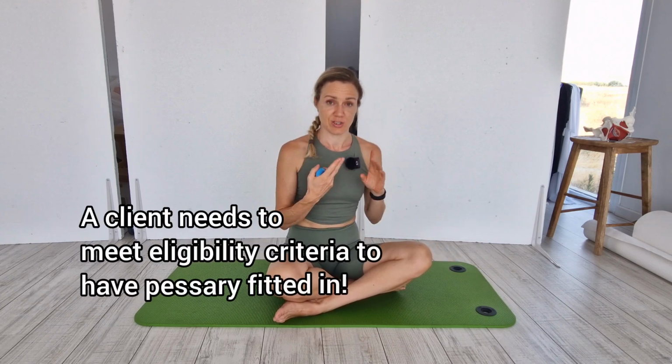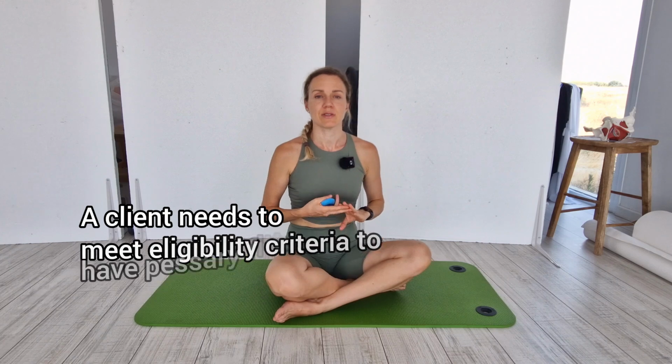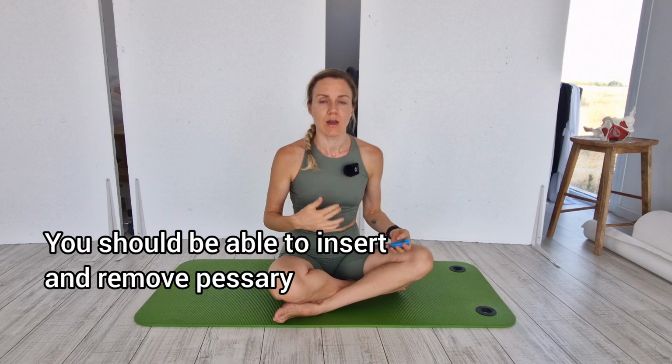But let's start from the beginning. When the client comes to me for pessary insertion, first of all, we assess the woman's will to have a pessary, if she's fit to have a pessary, if this is appropriate for her, and then we decide on which type of pessary. Let's say all this is done and we're going along the pessary route. One thing that I will make sure of is that the woman can insert and remove the pessary by herself, and this will be done in my clinic in front of me.